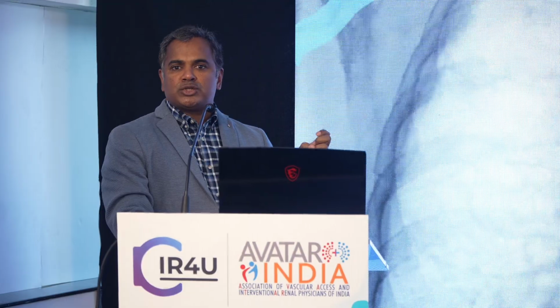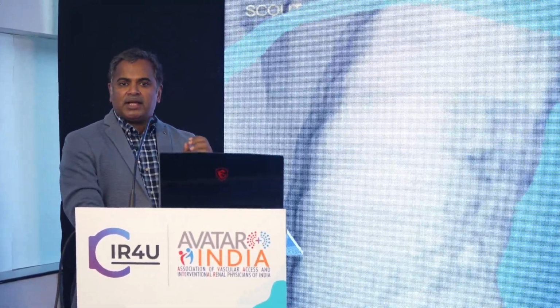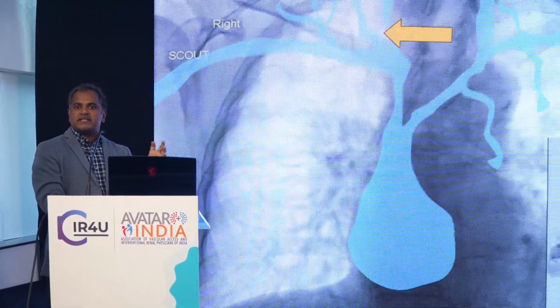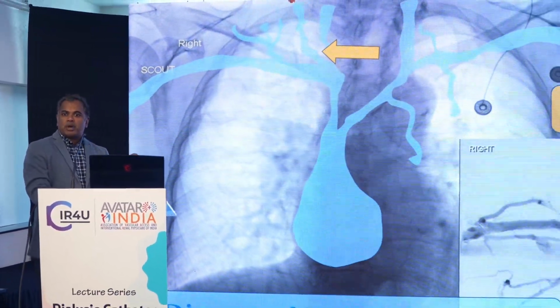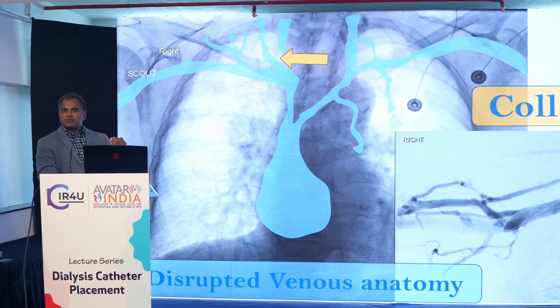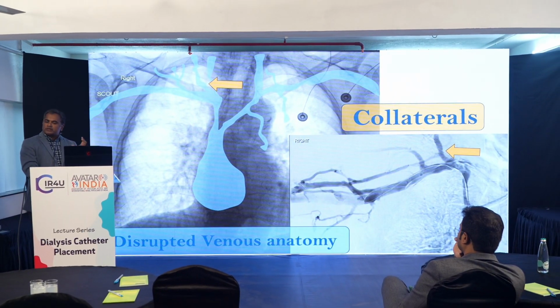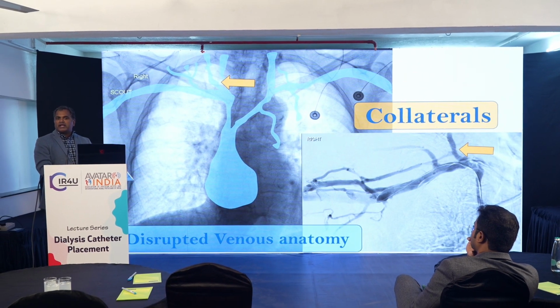And this is another scenario just demonstrating. See, IJV is the commonest vein that you come across. EJV, which is an external jugular vein, is next to the IJV. In a normal person with no increased atrial pressure, you won't see this prominent. You see this prominent when there is some narrowing in the other blood vessels. So if you see a prominent EJV, the first thing you should be thinking is, is there any narrowing in the central veins?